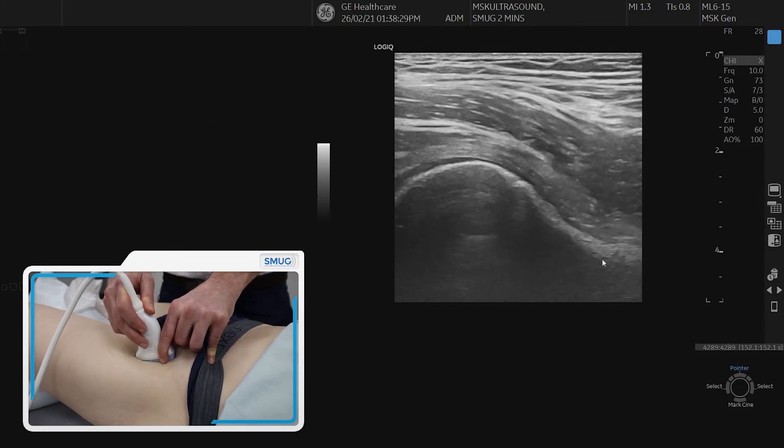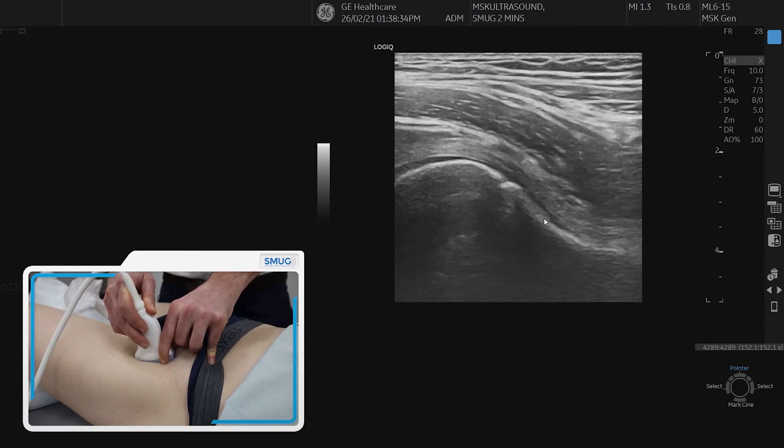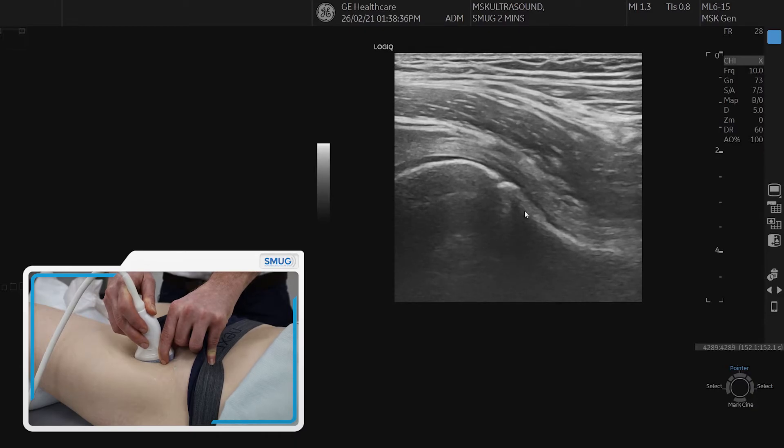It's really important to look for a cam lesion in this longitudinal section, which would be located just above the neck of the femur.